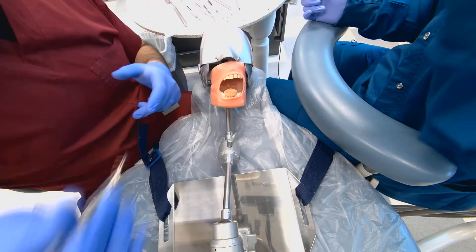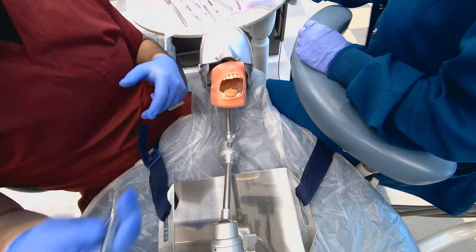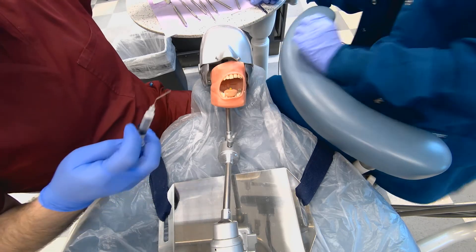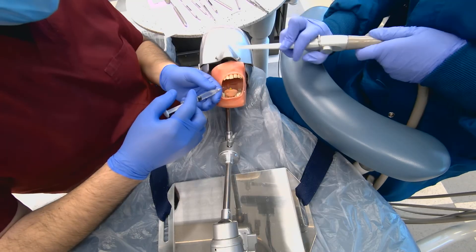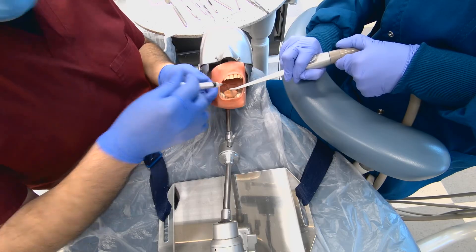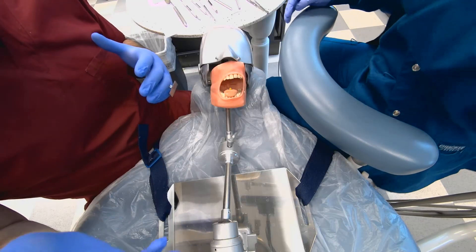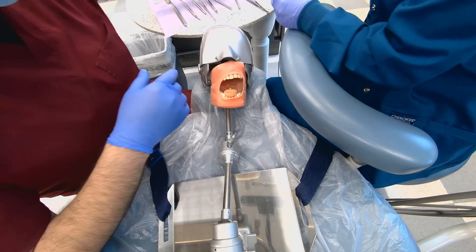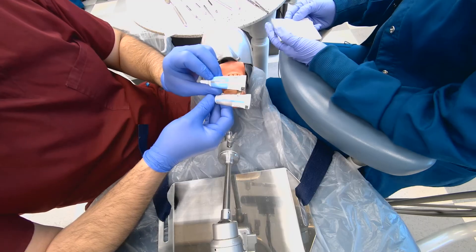Once we're satisfied and the x-ray looks good, we set the master cone aside and put some disinfecting solution on it. We then do a final irrigation one more time to make sure the tooth is completely clean. Now we're ready to cement and seal the canal using the sealer. There are different types of sealers available — we're just going to mix this one.